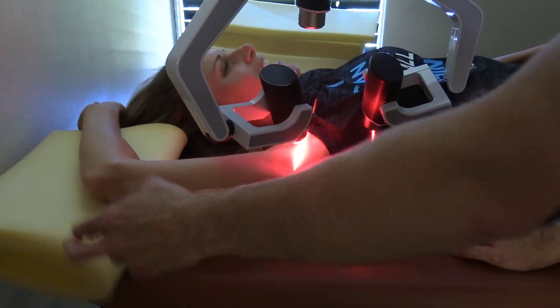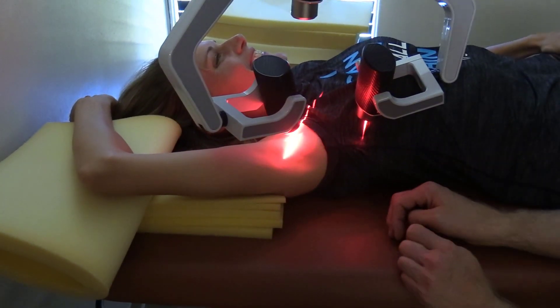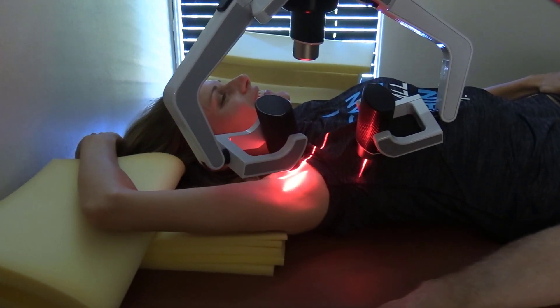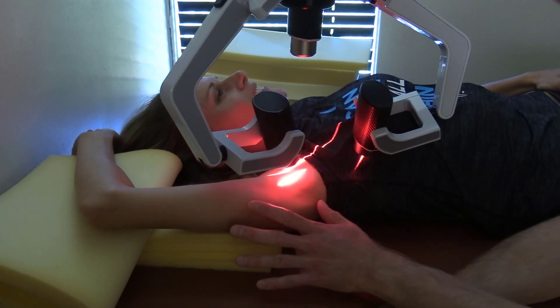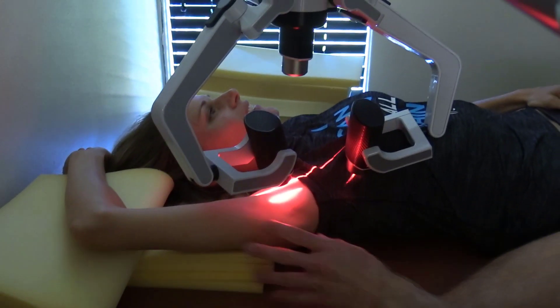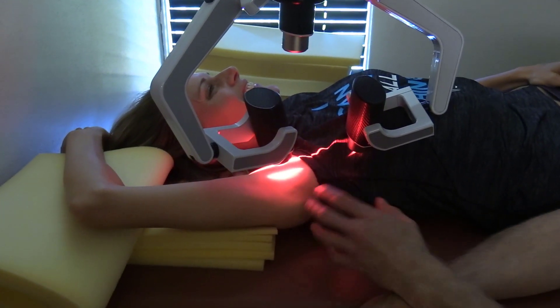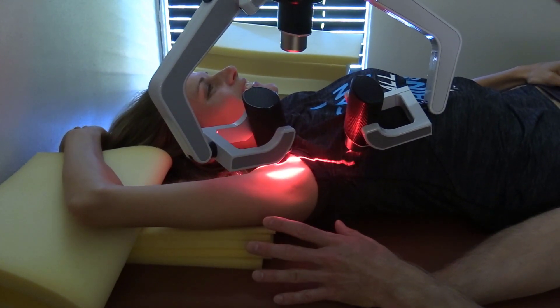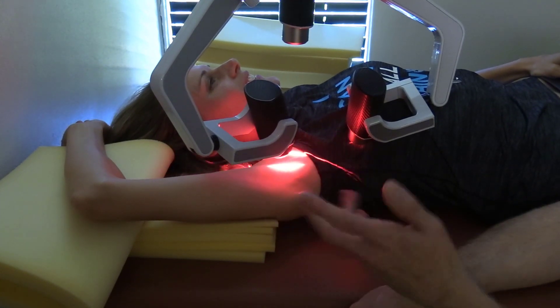You've got this extra piece of material from the corner to put underneath your arm. It's got to be comfortable because they're going to be here for half an hour, an hour, or even longer, depending on how long they want to do this. But this position for the shoulder is extremely uncomfortable after even 15 or 20 minutes — some people try to move their shoulder back down and it's a very icky feeling. So it's not polite to leave people here too long without giving them a break. They may not be too uncomfortable while here, but when they bring the arm down they will be.